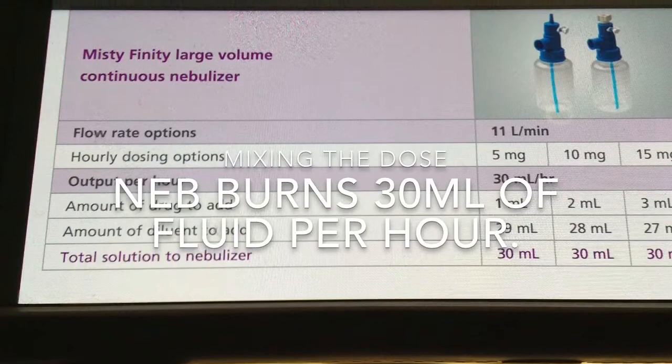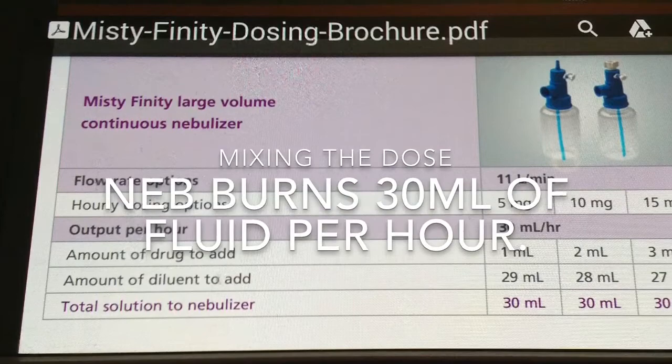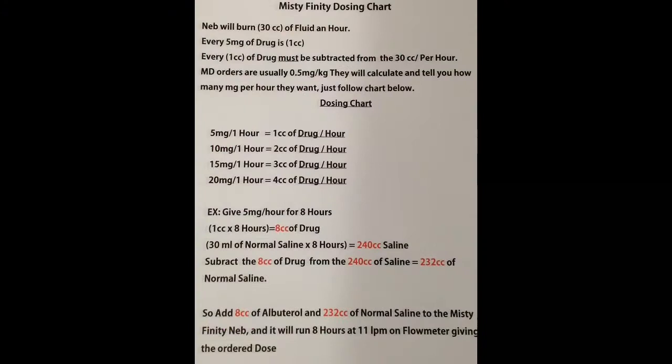The Pyxis is going to have a big vial of albuterol that makes the dosing a lot easier. The most important thing you need to remember is that this nebulizer will burn 30 cc's of fluid an hour. As you can see from the chart, mixing the normal saline versus the medication is simple math.